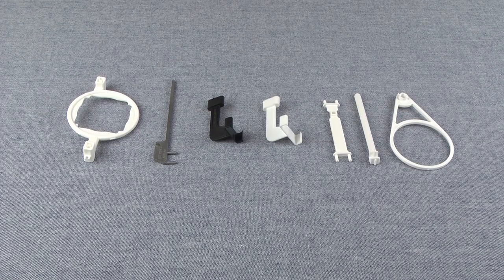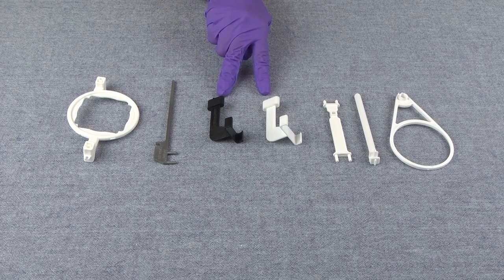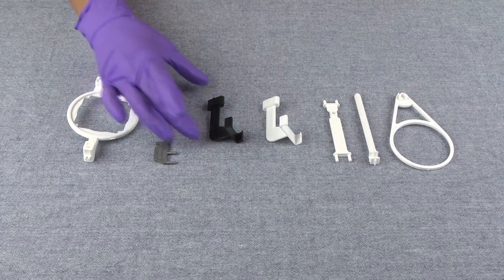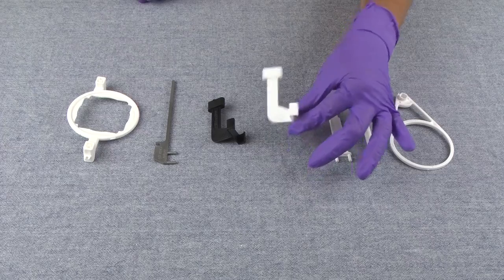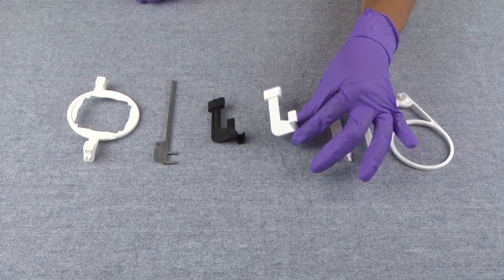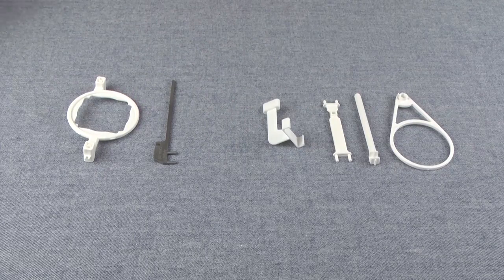In front of me, I have two bite pieces: a size 1 and a size 2. Both bite pieces are for a horizontal bite wing. The size 1 is black and a little smaller. The size 2 is a little larger and white. I'm going to be demonstrating how to put together a size 2 holder since that is the most commonly used sensor.